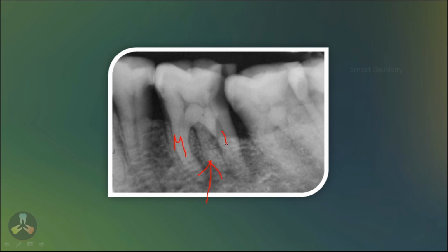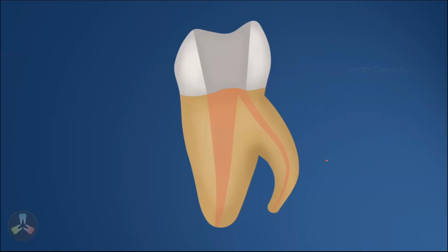But anatomically, this root will be protruding out from the other roots. This root will have a steep angulation. The problem associated with Radix Endomolaris is, for example, if we are doing cleaning and shaping for the distal canal, we can access the canal with a file vertically from the prepared axis.